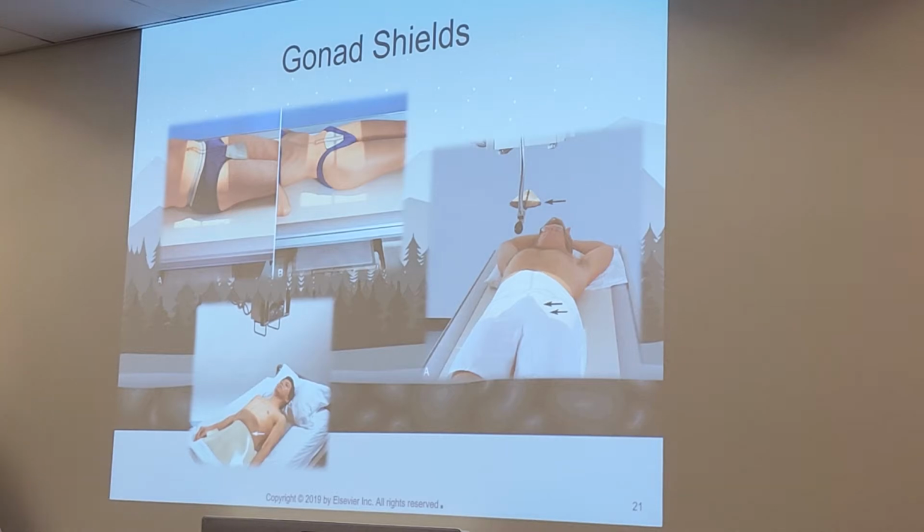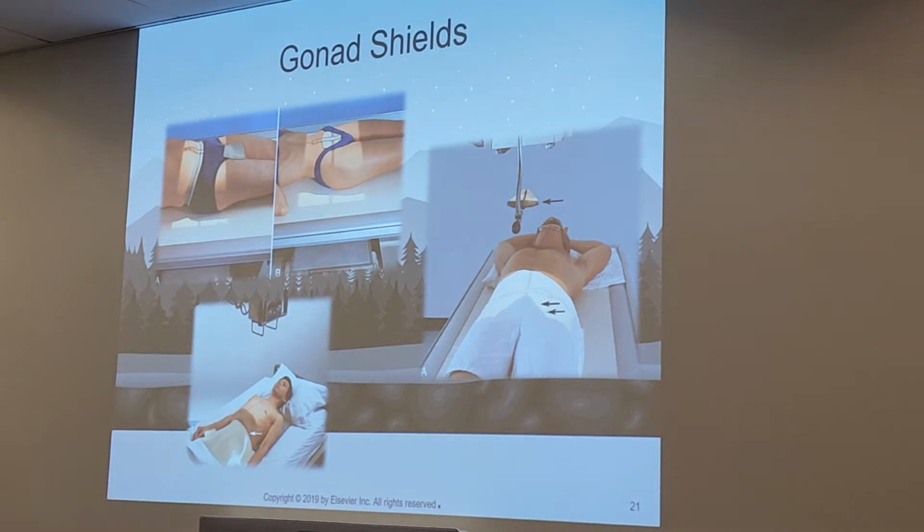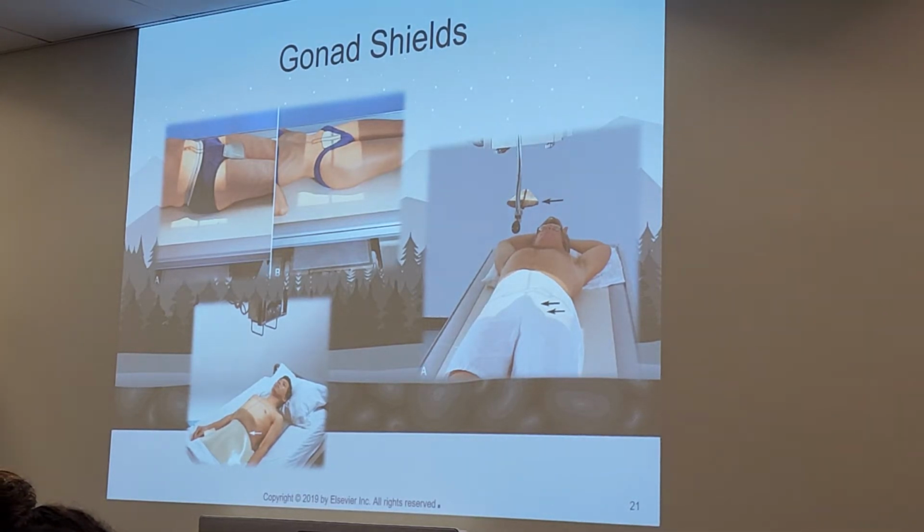Now, I will take this time to give you all a heads up. A lot of times, after people go from students to techs, they begin to try and take shortcuts. One of the shortcuts that you may see out at the clinical sites in the fall is that some techs will not shield their patients. Okay? Whether it's for speed or whether it's just because they don't want to put in the effort, I can't say. But you will see techs that do not use shields on patients.